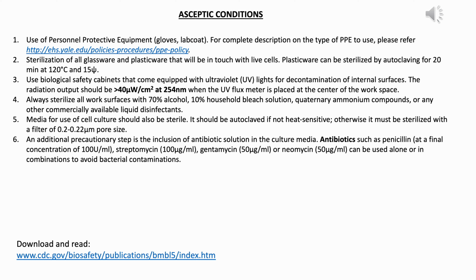In addition to following all these methods for aseptic techniques, one can take precautionary steps, which include using antibiotic solutions in your culture media. Typical antibiotics to avoid bacterial contamination: some antibacterial agents one uses are penicillin at a final concentration of 100 units per ml, streptomycin 100 microgram per ml, gentamicin 50 microgram per ml, and neomycin 50 microgram per ml. These are some commonly used antibiotics. Invitrogen and many companies directly sell the penicillin-streptomycin combination, which is the most popular among the antibiotics.